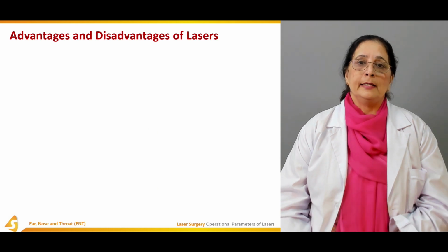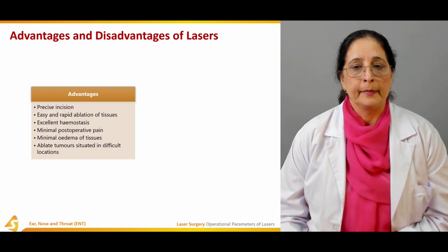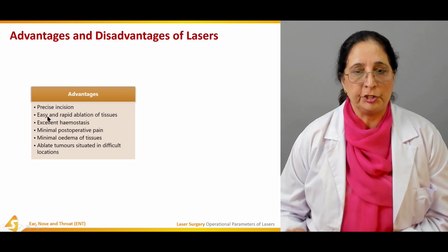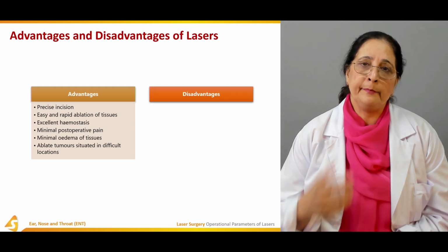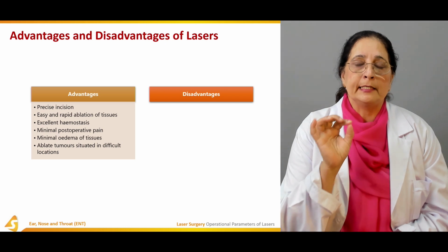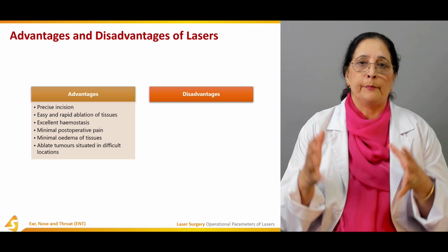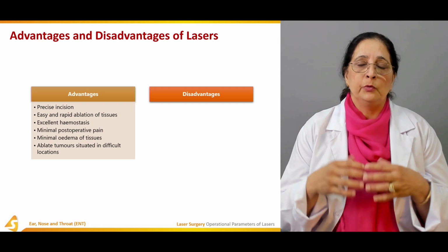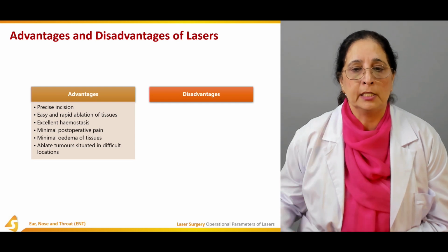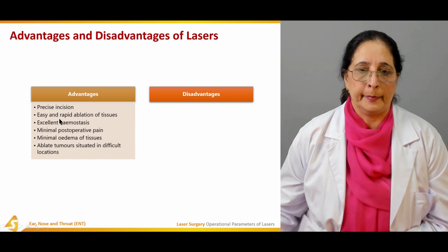Now some advantages and disadvantages of laser. Advantages: we have precise incision. As I mentioned, a very precise incision is given, not the wide laparotomy incisions to access the structure. So a very precise incision is one very important function of the laser therapy.